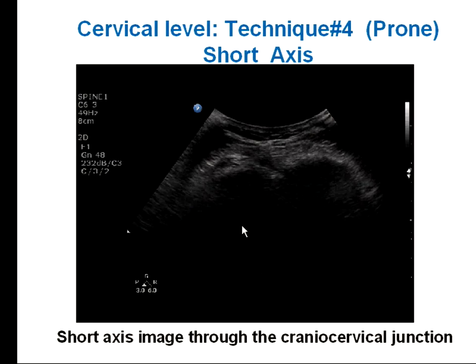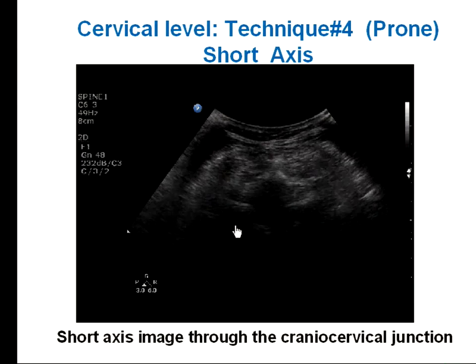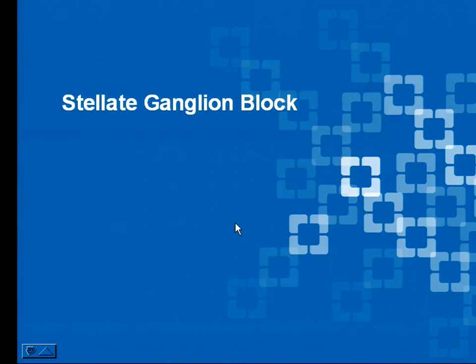If the patient is prone but in short axis, you start to see the occiput, and then the first, very rudimentary spinous process, this is C1. You cannot miss the first bifid spinous process, of C2. So this is a quick review of the sonoanatomy from anterior and from the back to differentiate the level.